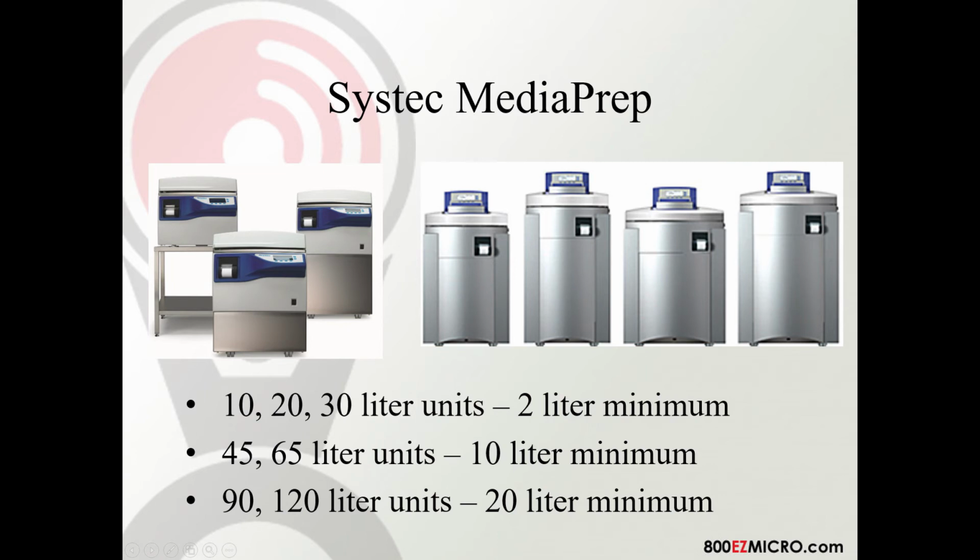The 10, 20, and 30-liter units are all built on the same chassis that you can see on the left-hand side of the screen there. All of those units have a 2-liter minimum, with the top end being the 10, 20, and 30. The 45 and the 65-liter units have a 10-liter minimum volume, and then the 90 and the 120 have a 20-liter minimum in each of those units.